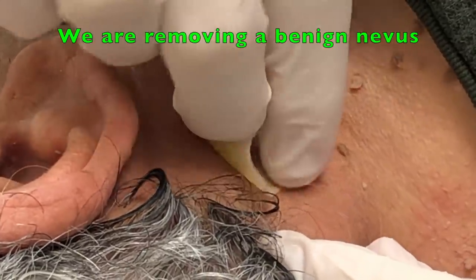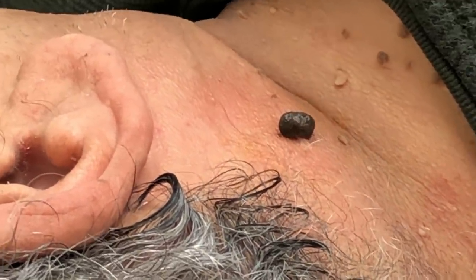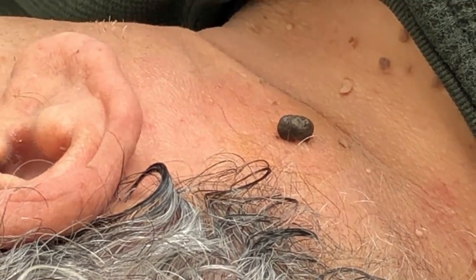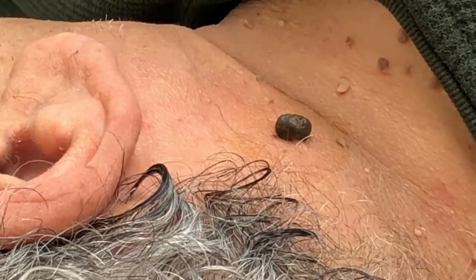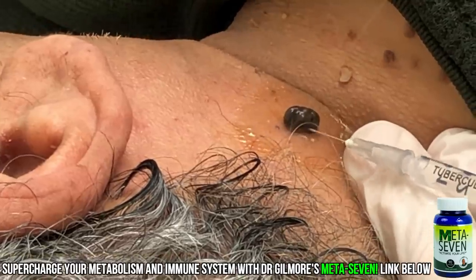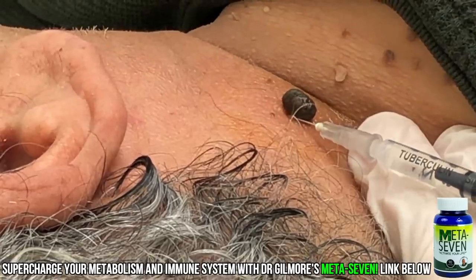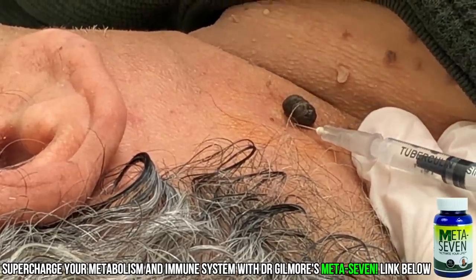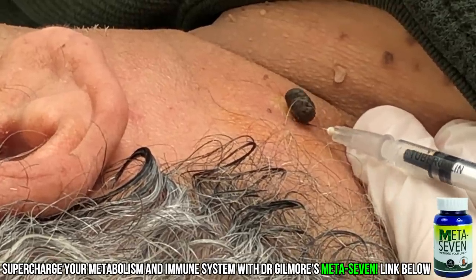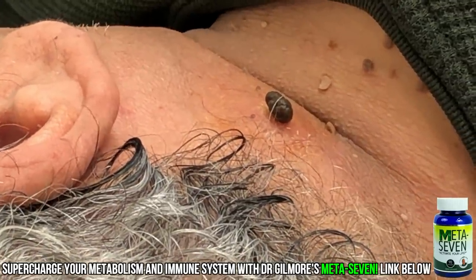And you're okay if we call you jellyfish and record your video for our friends on YouTube? I'm ready for the syringe. You're going to feel a little sting and you're going to get a little cold spray. She's going to spray a little cold spray right on that. Burr. Here comes a sting. Stick, sting, and a burn. There it is. Stick, sting, and a burn. Come in here a little bit more. Just a little sting, my friend. There you go. Scissors, forceps.